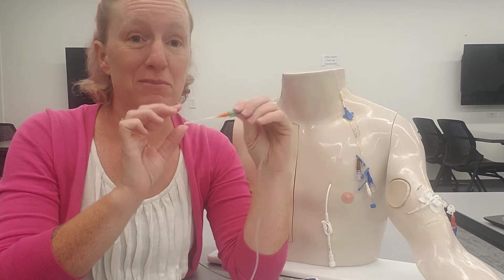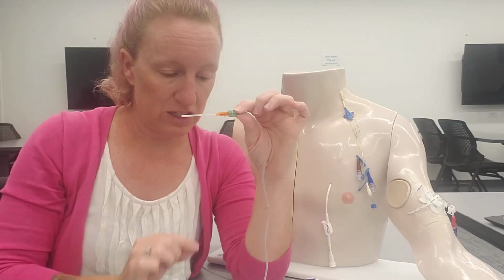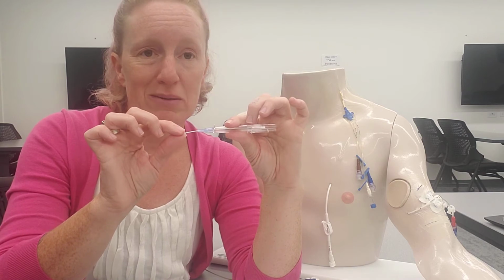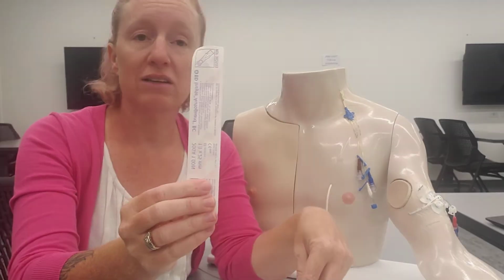Now, there are times when we need different sizes. If I've got somebody who's bleeding out and I need to get in some fluid and I can't get a central line in quick enough, I want a big access device. I want a nice 14 or a 16. Versus if I have somebody that is just getting a little fluid before surgery or something like that, a 22 might be fine. 18s are kind of green, 20s are kind of pink.